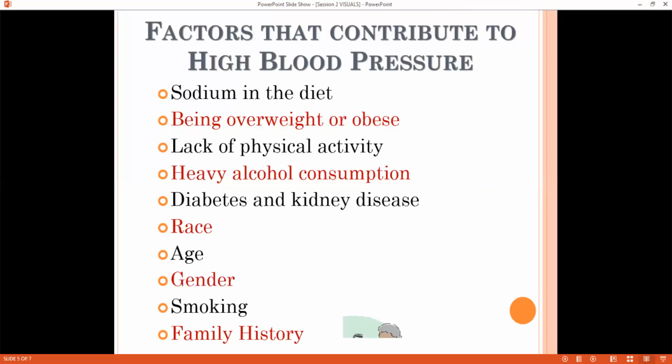He or she slowly lets the air out of the cuff, reducing pressure on the arm and allowing the blood to flow again. The blood pressure reading shows up on the pressure registering device attached to the cuff, either a screen or a number dial with a pointer. Each blood pressure reading has a pair of numbers showing the highest and lowest pressure during each heart cycle. The highest number is called the systolic pressure and the lower number is called the diastolic pressure. Blood pressure is measured in millimeters of mercury.